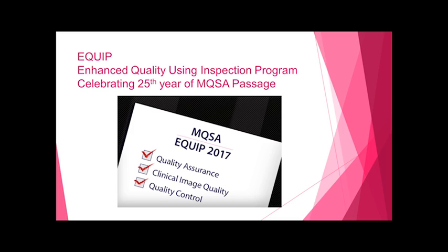So EQUIP, what does it stand for? Enhanced Quality Using Inspection Program. It came out celebrating the 25th year of MQSA passage. So these are issues that the ACR feels need to have more attention paid to them, even though we've been doing it all along. They just want us to pay a little bit more attention to these three categories, which are quality assurance, your clinical image quality, and your quality control. So we're going to go over each one of these.